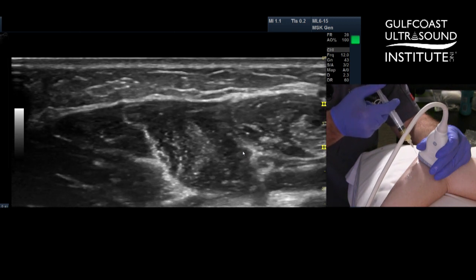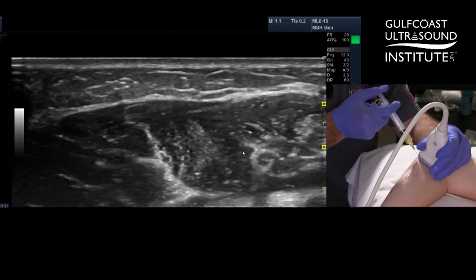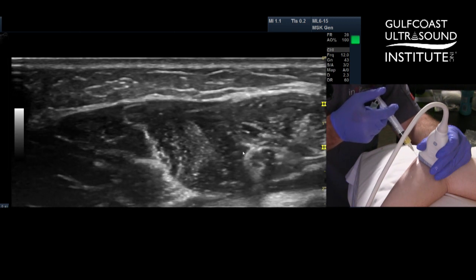Doing okay? Nothing down your arm? There we go. Got it.